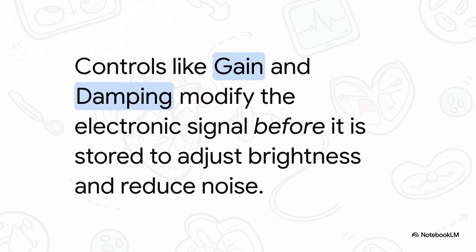The really crucial thing to remember here is that these adjustments are made to the raw analog signal in real time before it ever gets turned into a digital file. You can't undo them later.